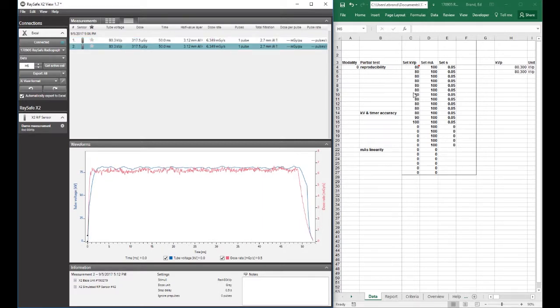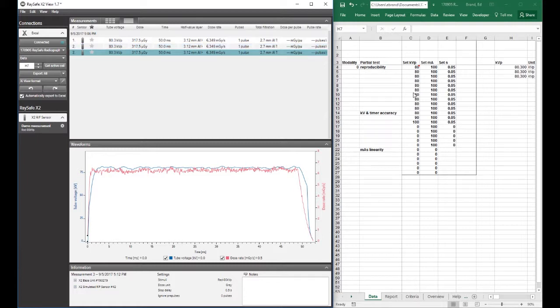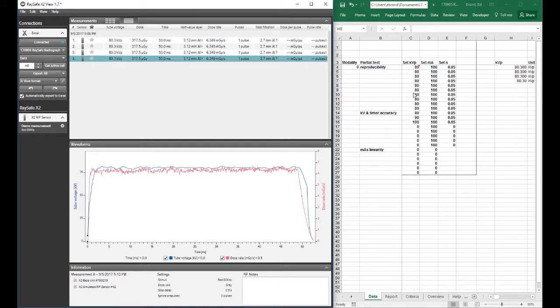So it calls for several 80 kV exposures in a row. So I simulated the first one. I'm going to do a few more.